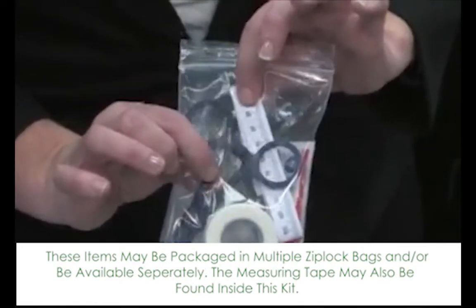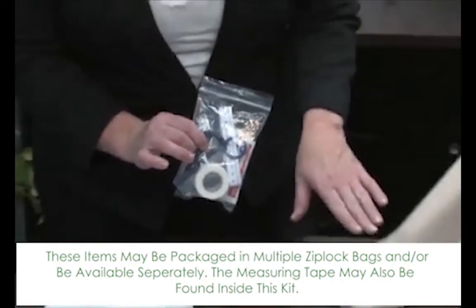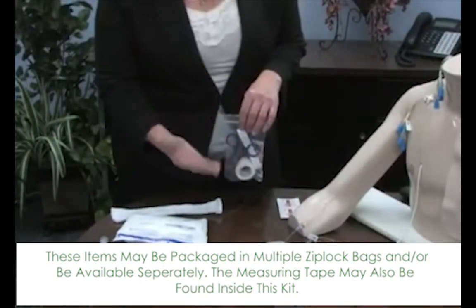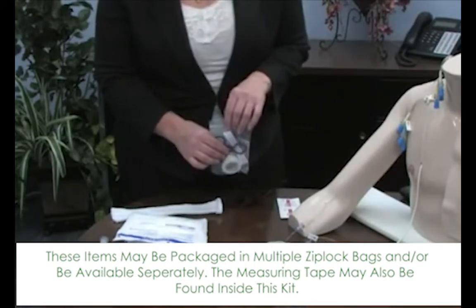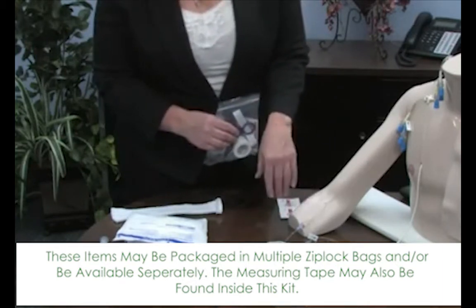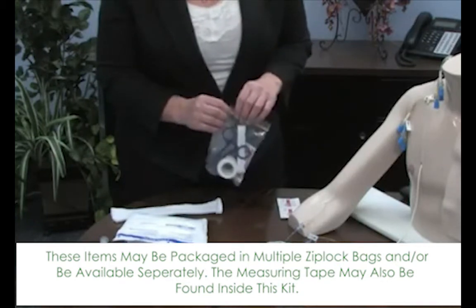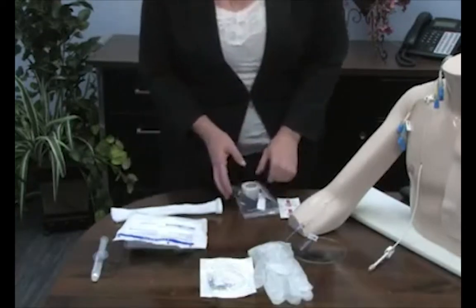The measuring tape here is used to measure the external amount of catheter on the PICC lines that are outside so that you can document how much of the line is outside, because that has to be measured each time you do a dressing change. If for some reason that has come out further than the original site was assessed, then an x-ray has to be done to verify where the tip is. So it's important to do that step, and we provide this to make sure that you have it.